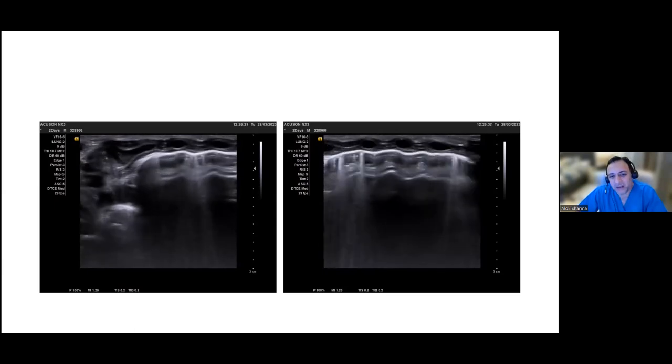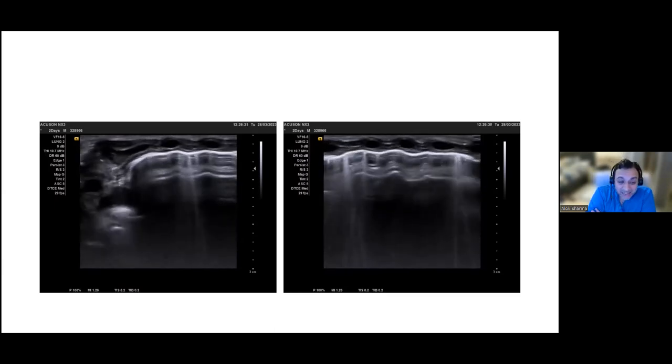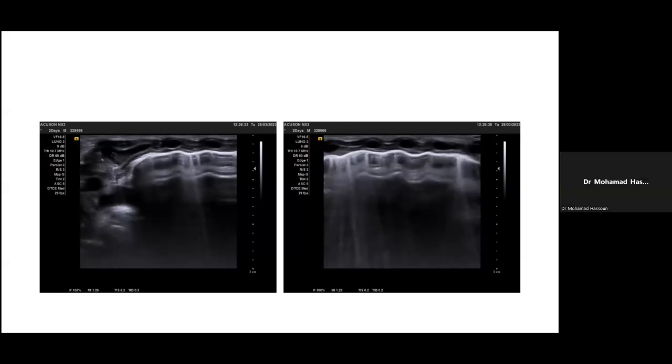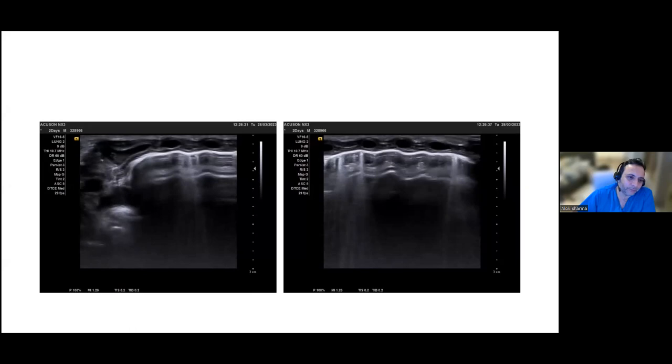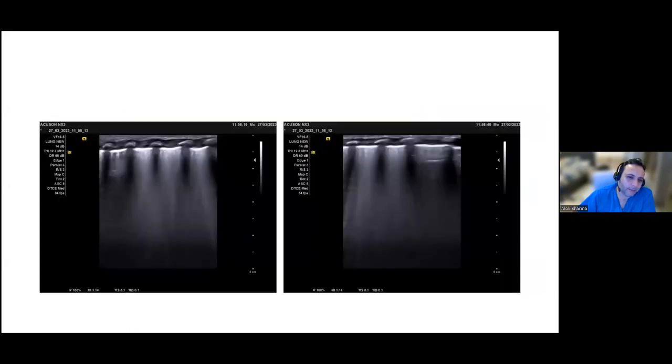But we also know the CRP is elevated, and infection in combination with that can sometimes make the lungs deteriorate a little bit worse. I can't see anything that would suggest to me pneumonic consolidation. If we just go back to your previous image. Yep, just this one here. So if you just play them.